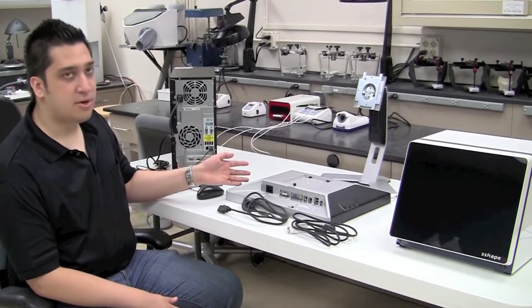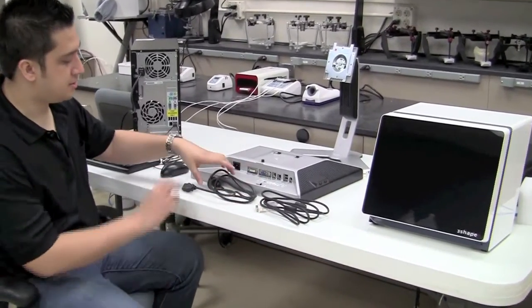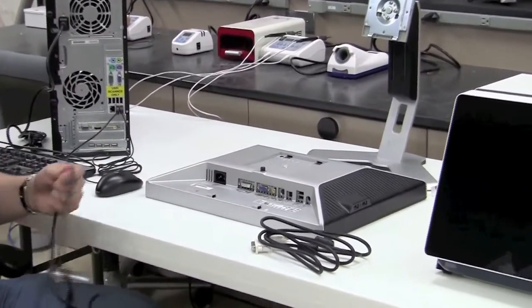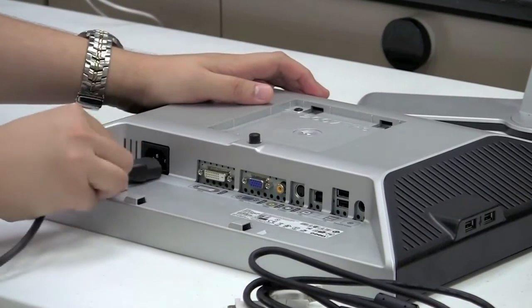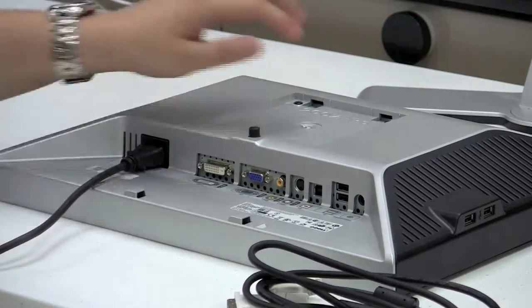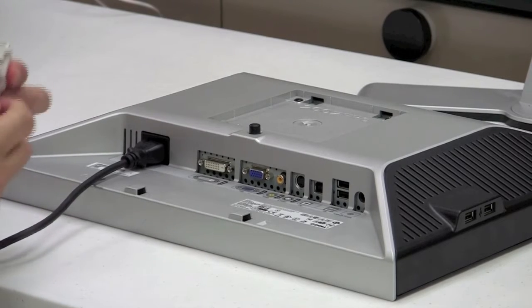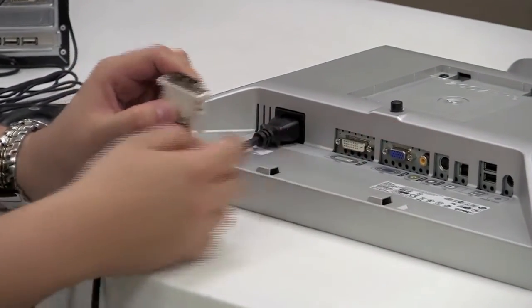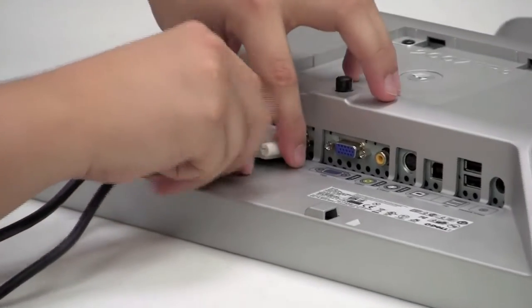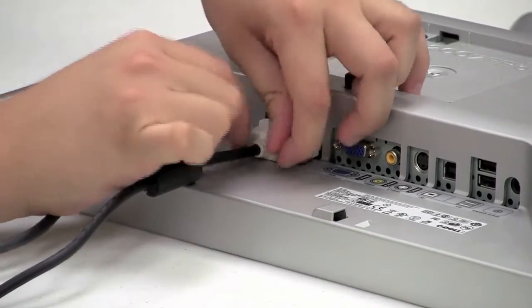Now we're going to plug in the power cable and video cable to the computer monitor. We want to plug these cords in before mounting the monitor on the base, as it's easier to access. With the monitor facing down on the table, plug the female end of the power cable into the back of the monitor. With the DVI video cable, there is a specific orientation — make sure the small flat connector matches with the flat female insert on the bottom of the monitor. Once plugged in, there are two small screws on each side of the cable to hold it securely in place.